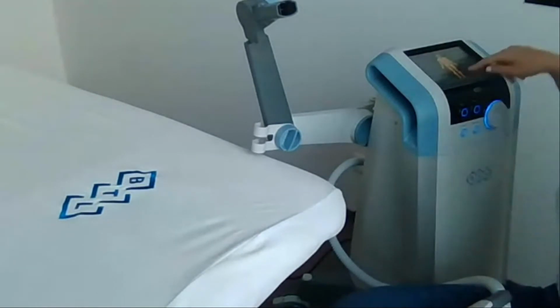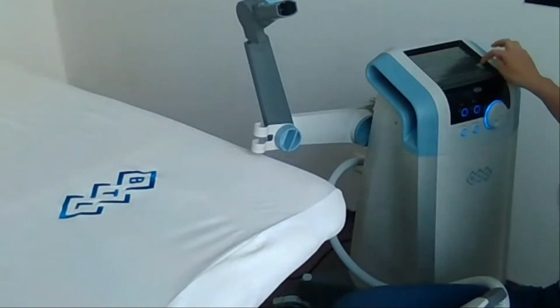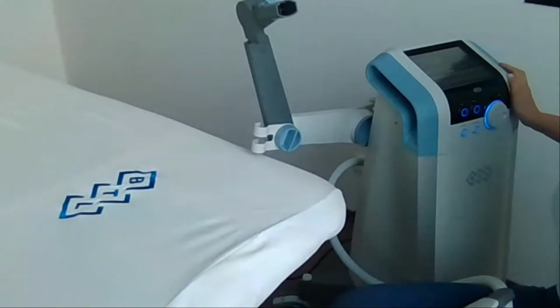So we can go through the list. We can go with this anatomic body part, or we can go directly through the list. So it is up to us how we want to find the protocol. So let's go right now into the muscle strengthening, and please listen now how different the first section is, when we have to set the intensity level, how different the frequency is.